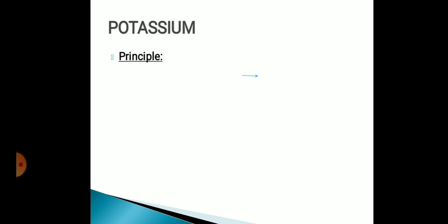Next, on the principle of potassium. Potassium reacts with sodium tetraphenyl boron in a specially prepared buffer to form a colloidal suspension. The amount of turbidity produced is directly proportional to the concentration of potassium in the sample.